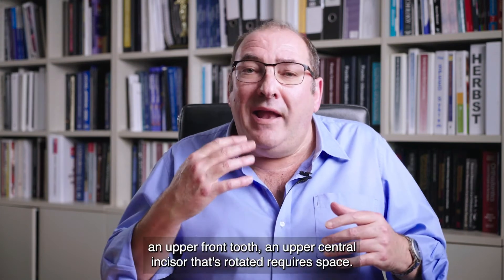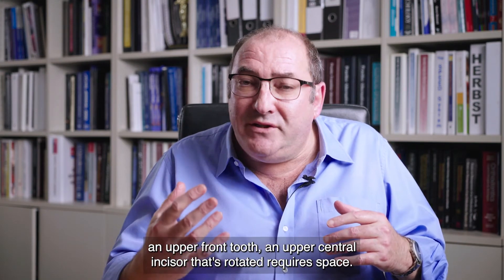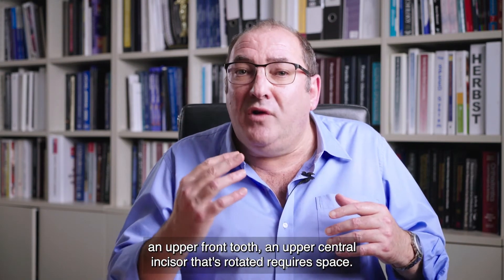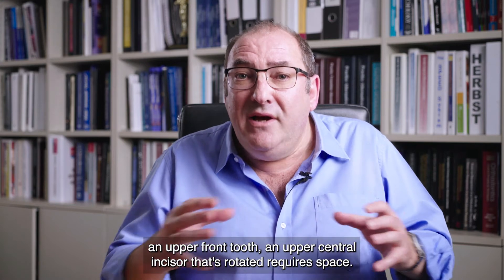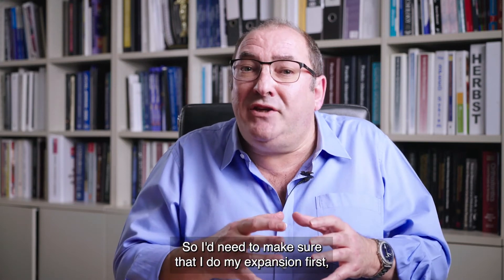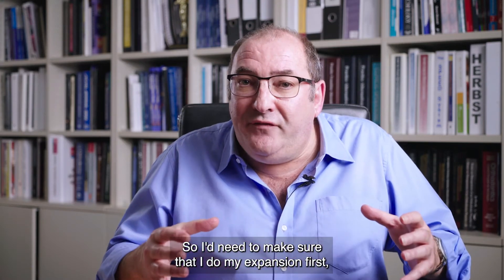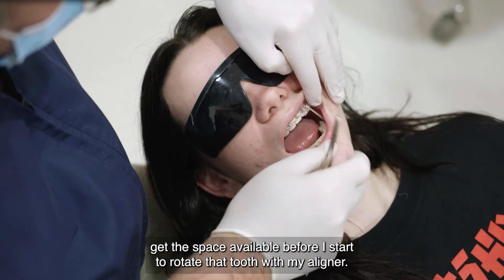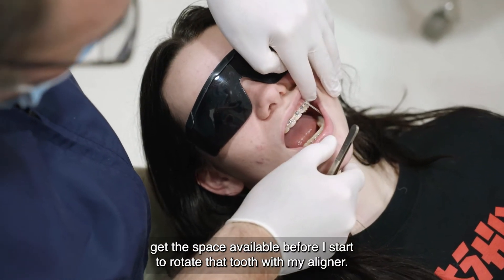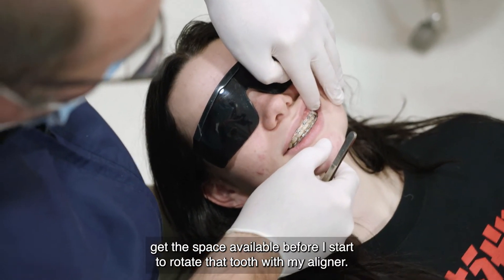For example, an upper central incisor that's rotated requires space, so I need to make sure that I do my expansion first to get the space available before I start to rotate that tooth with my aligner.